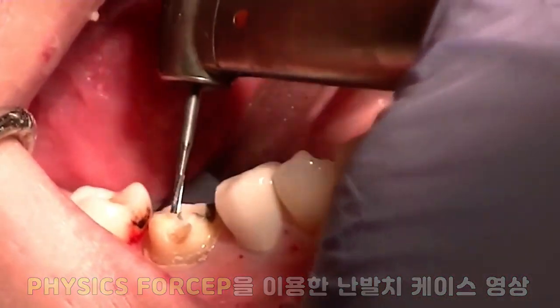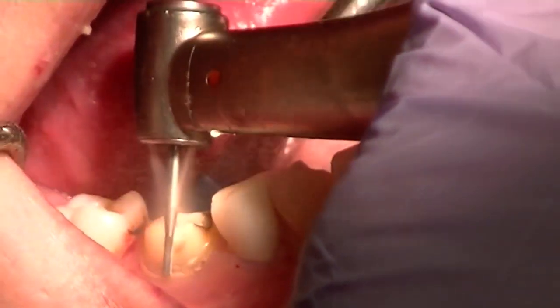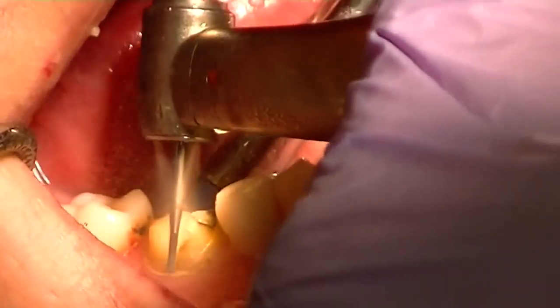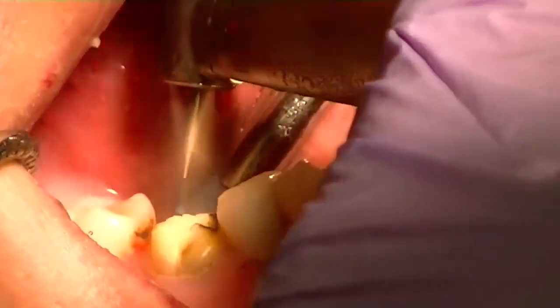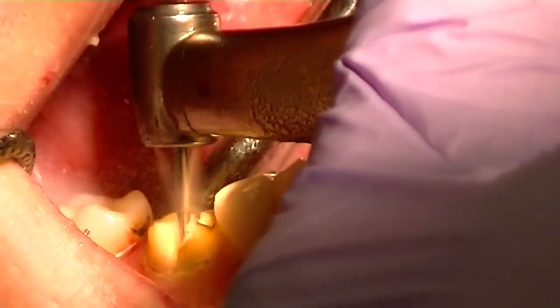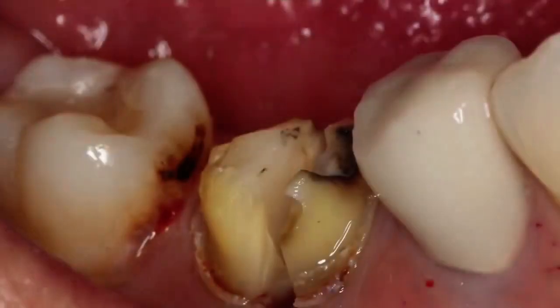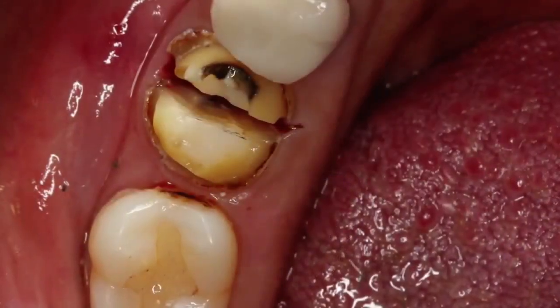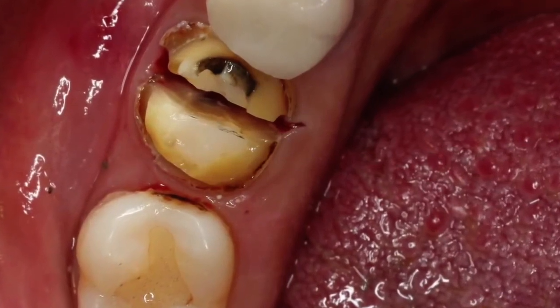We have a two-rooted mandibular tooth that we want to section. We want to make sure that we follow the direction of the furcation and that we make our penetration all the way through to the furcation so that the mesial and distal roots are completely separated.